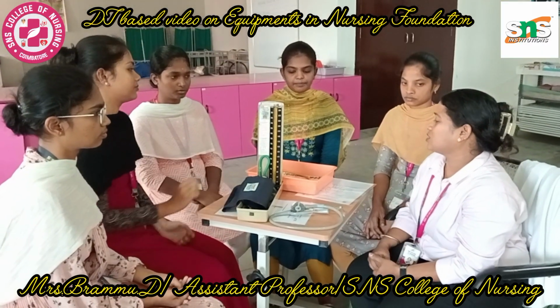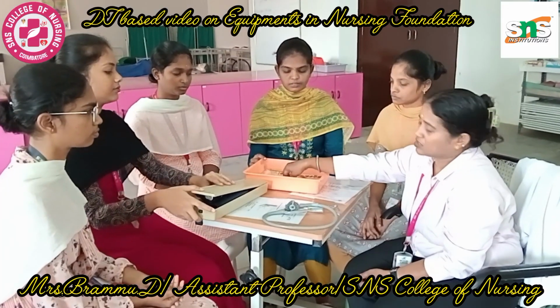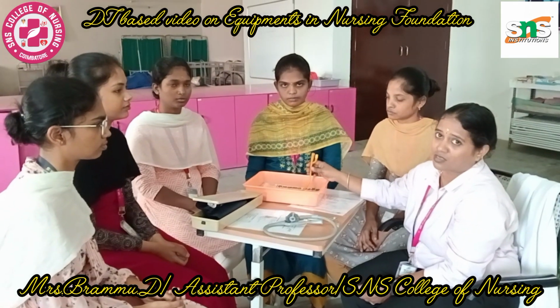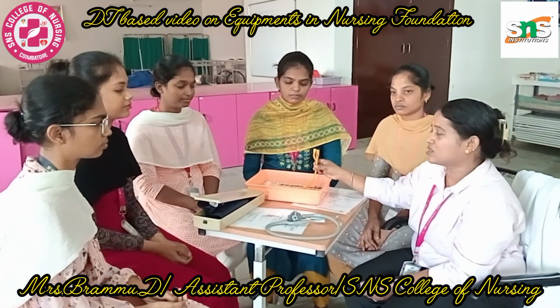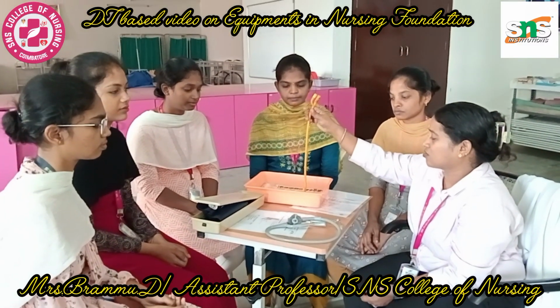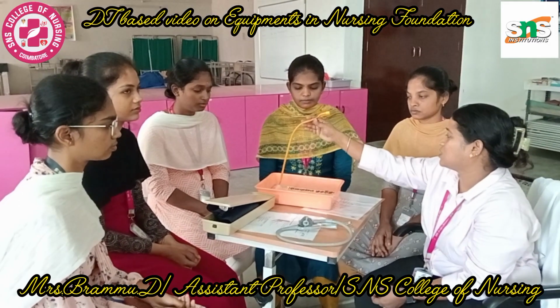Next, which we frequently come across at the patient bedside: all patients who are bedridden, or who are having surgeries in and around the abdominal area, unconscious patients, comatose patients, and patients who are at fall risk, will be having the urinary catheter, or what you call bladder drainage. So this is the Foley's catheter, which will be explained by Ms.